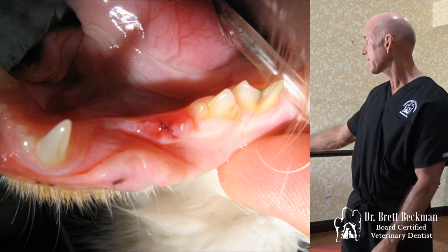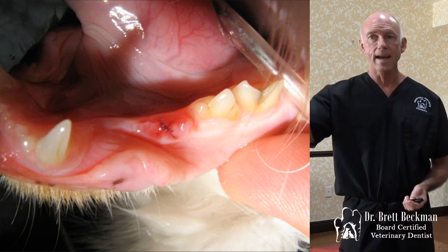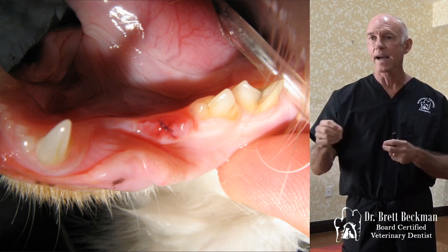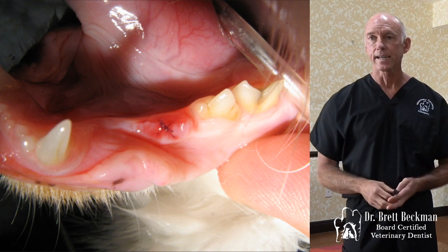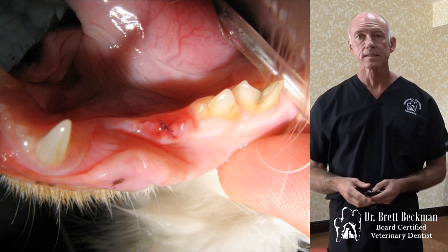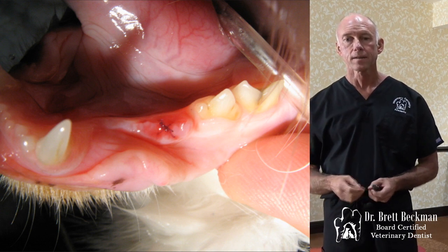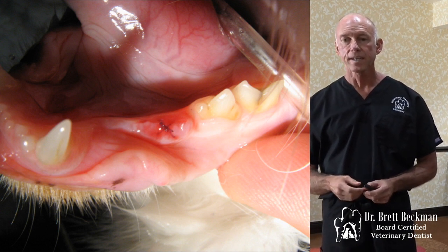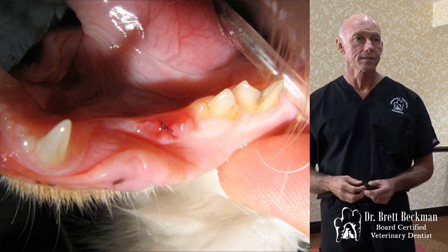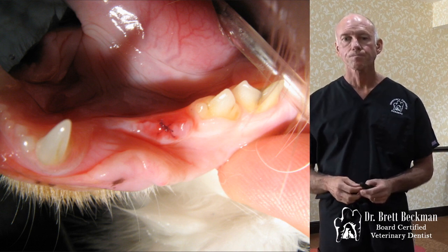So we make a pass here and then make another pass caudal to it without tying the suture, and then tie it once into that little figure 8, and you're done. So quick, easy, and taking care of all the disease there. That will heal. You won't be able to tell in a couple of weeks. So pretty easy.